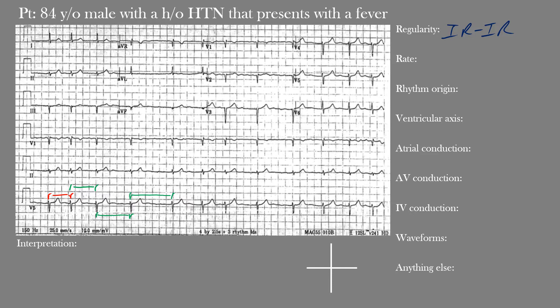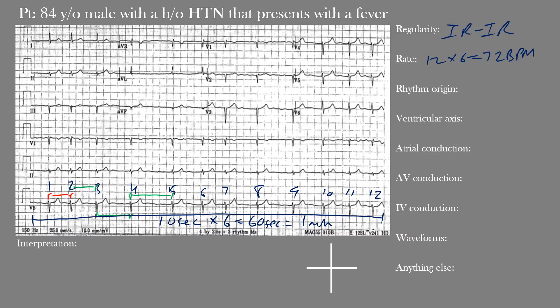Now, what did you get for the heart rate? We're dealing with an irregular rhythm, so how do we find the rate? The whole standard 12-lead EKG represents 10 seconds. If you multiply by 6, that's 60 seconds, one minute. So if we count the number of QRS complexes across the EKG and multiply by 6, we get an estimate in beats per minute. Counting here: 1, 2, 3...12 complexes. 12 times 6 equals 72 beats per minute — which matched the actual EKG machine reading exactly.